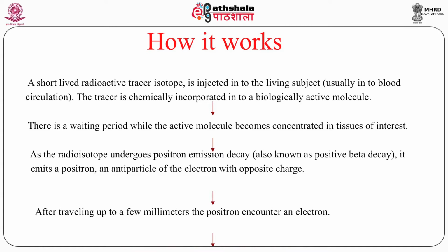Again, as I am telling you, what is fluorodeoxyglucose? It is a kind of glucose, labeled with the isotope fluorine. Your cells which are very active and require energy for their further work, which we do day in day out, require glucose to become active.